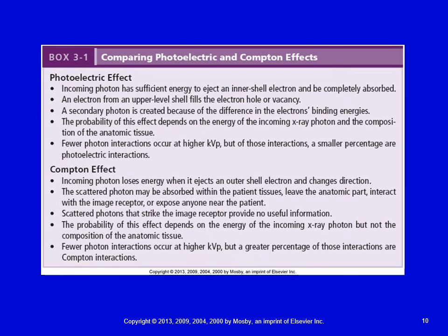All right, moving on to the second one, looking at that Compton scatter. With Compton, we have an X-ray photon coming in. It will usually interact with an outer or middle shell electron, not an inner shell electron. It has enough energy to knock it out of its shell, but it's not going to give up all of its energy knocking it out. It's only going to give up some of its energy, and then it will change directions and keep moving within the patient's body.